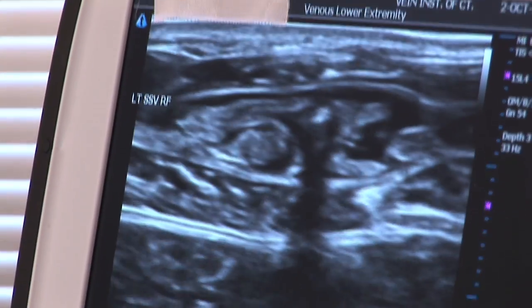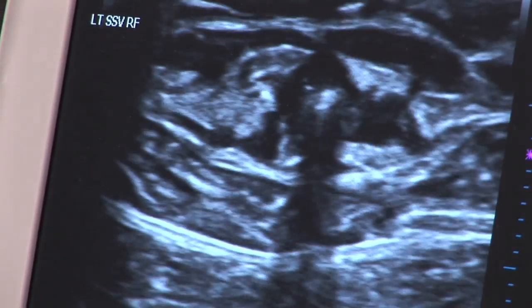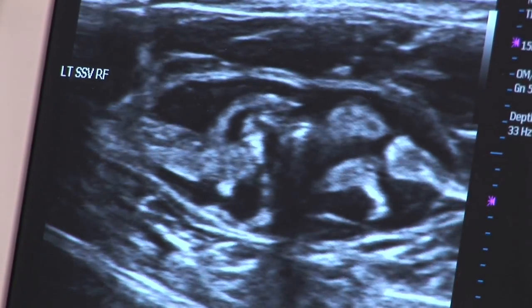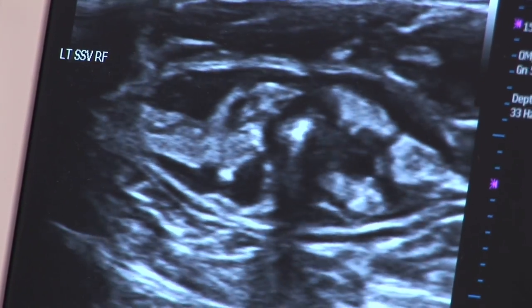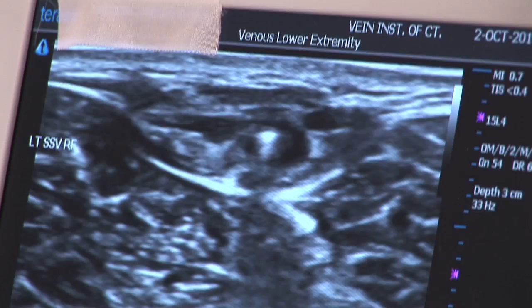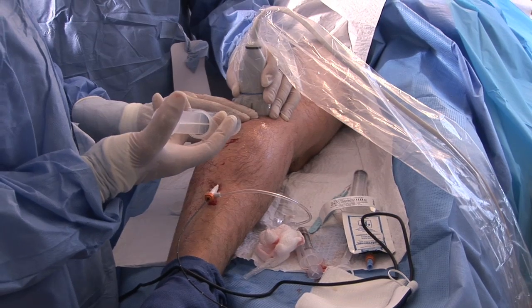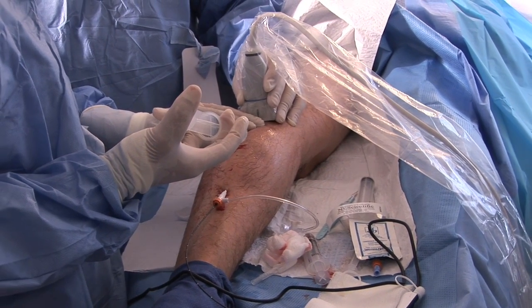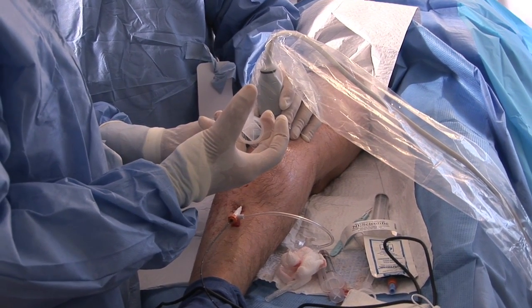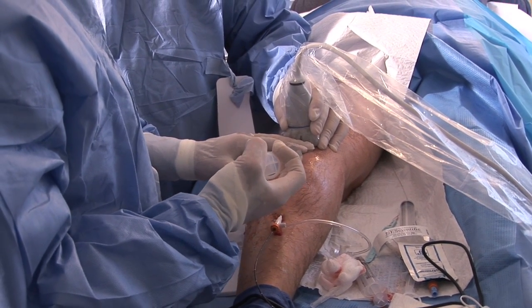The white dot that you see in the middle of the screen is the fiber inside the vein. You see that the black area is increasing in size — that is the fluid. The black area is the fluid that we are injecting, which is the anesthetic fluid — normal saline, lidocaine, and bicarbonate. We do that all along the length of the vein, starting from our insertion point all the way to the tip of the catheter. Once the temperature on our monitor drops, we know that we have anesthetized the whole length of the vein.